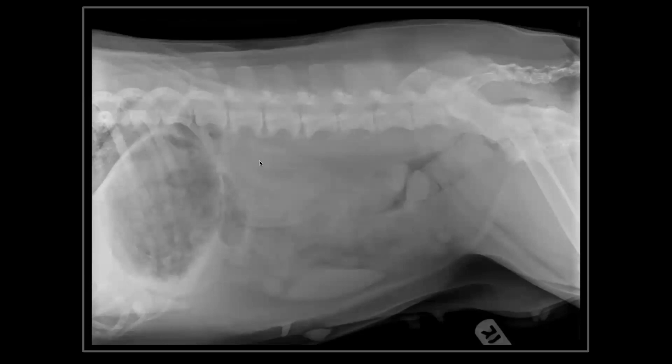And this is a middle stage. You don't quite have bridging yet, but you have early bone formation. It's an earlier phase of spondylosis between several of the lumbar vertebrae. Again, routinely we'll pick up spondylosis even when we're not looking for it.